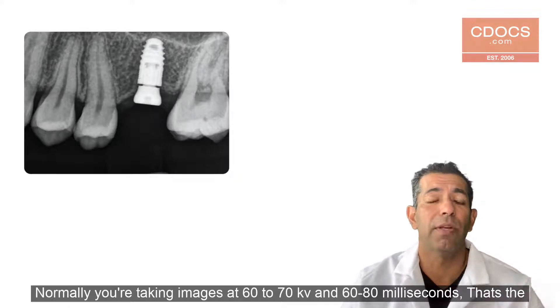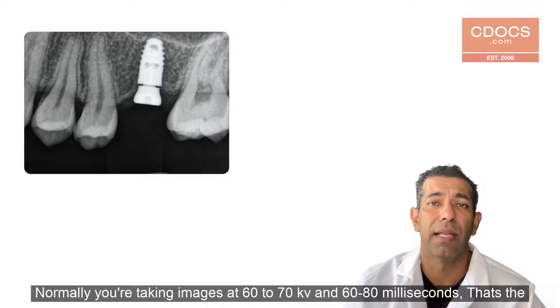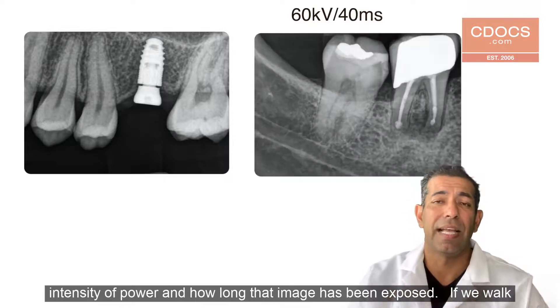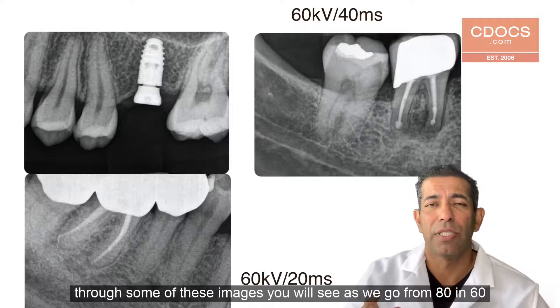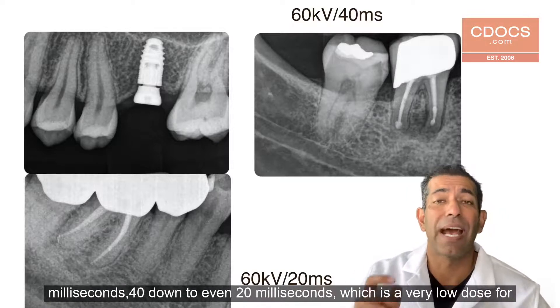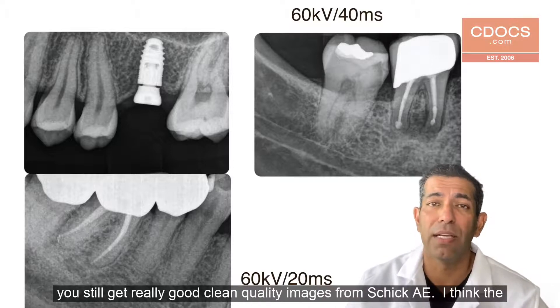You also have the ability to take images at a lower dose. Normally you're taking images at 60 to 70 kilovolts and roughly 60 to 80 milliseconds — that's the intensity of power and how long that image has been exposed. And if we walk through some of these images, you will see as we go from 80 milliseconds, 60 milliseconds, 40 down to even 20 milliseconds, which is a very low dose for patients, you still get really good, clean quality images from Schick AE.